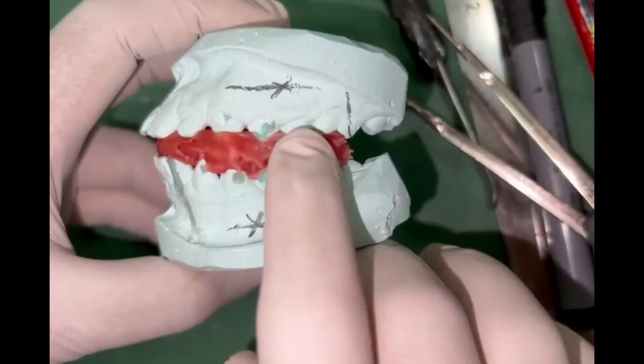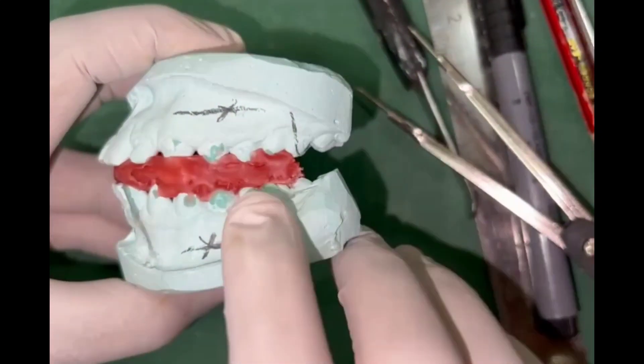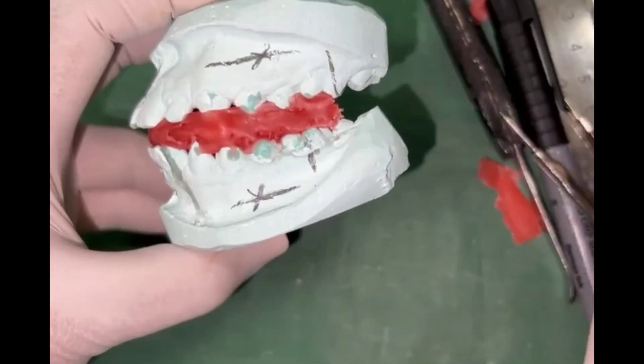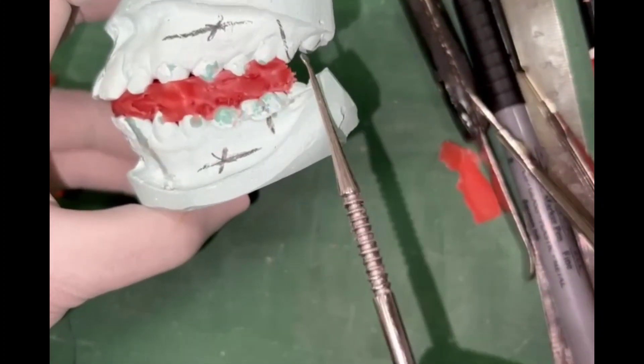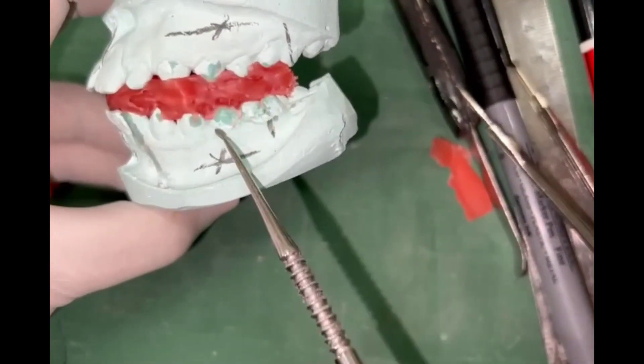After the bite registration, cut off the excess so that you can clearly see the molar relationship. You should try to achieve a super Class I molar relationship and measure the amount of sagittal advancement and the vertical opening of the bite.